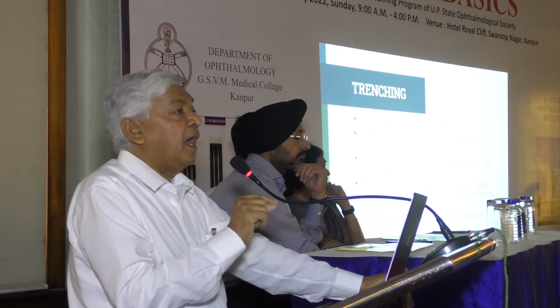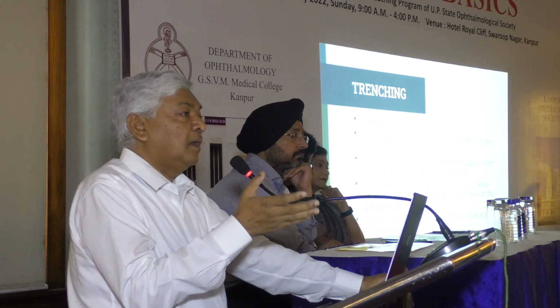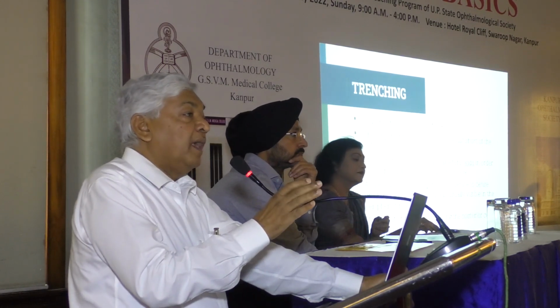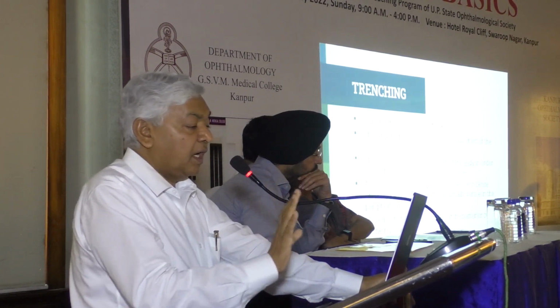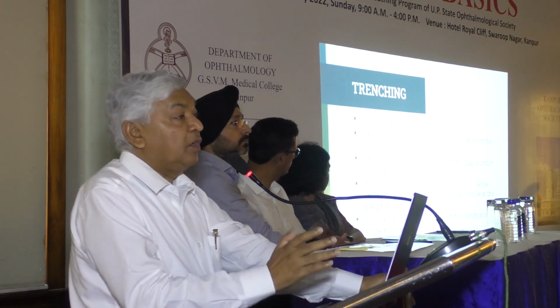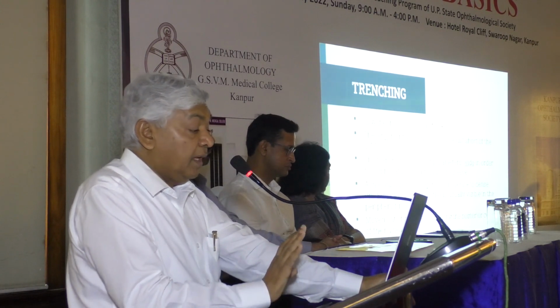The phaco tip will not be accommodated, and it will push the nucleus downward and inferiorly. Then what will happen? Subluxation may take place. So make a sufficient width, one to accommodate the tip, and the other way, cracking into halves will be much easier. So it is again very important. And achieving adequate depth is again very important. The depth should be sufficient so that you are able to get a red reflex. Gradually you have to make sufficient depth.